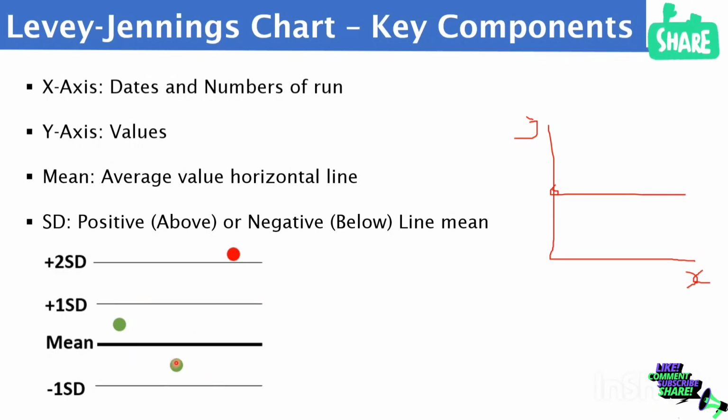But once the quality control point goes above these two standard deviations, as you can see here, that is not very good, and it means we need to investigate it. There are a number of reasons that could lead to this. It does not necessarily mean the process used to run the test is wrong. However, the approach used in running the test may be wrong.